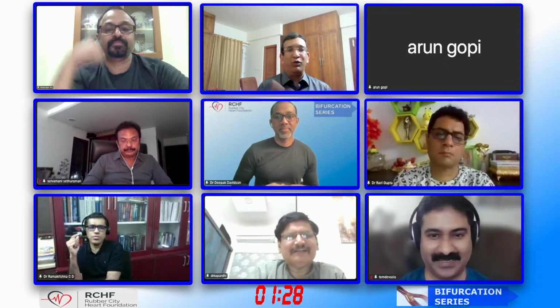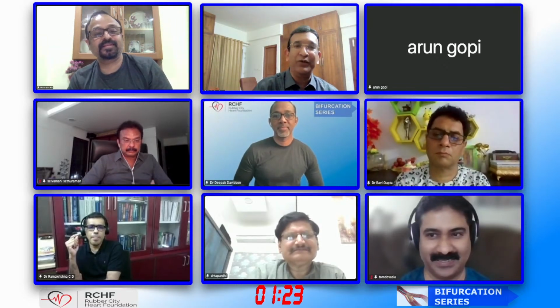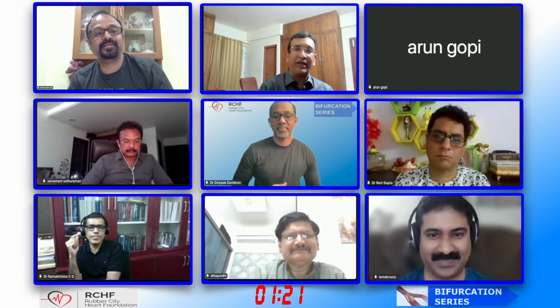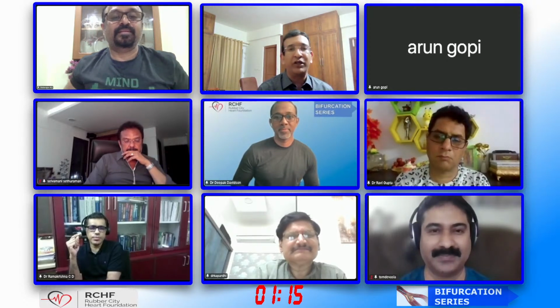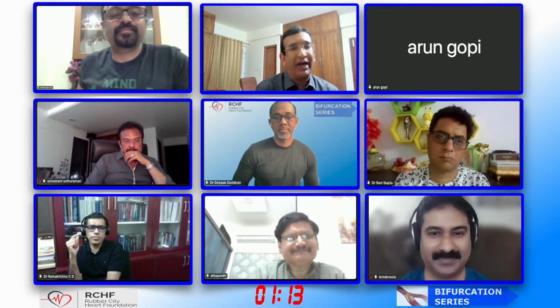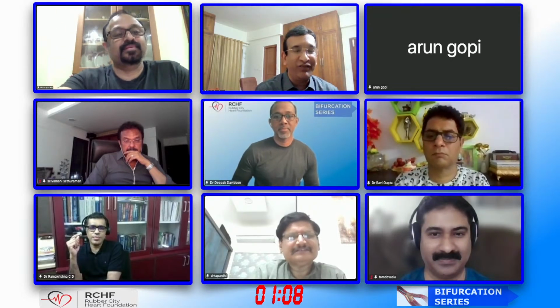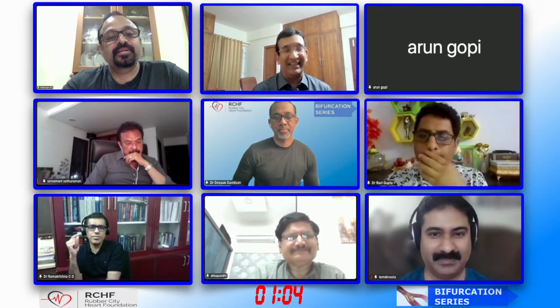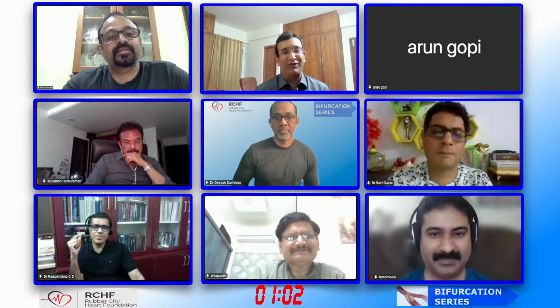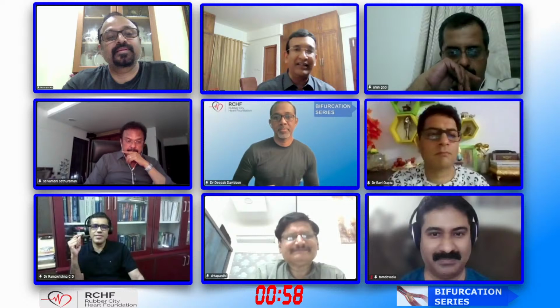Like you would know what you've done, Natarajan. I mean, you're just trying to be nice, but essentially it's this way. You can have the wire going whichever way. You can have the wire going straight, but you can have the wire going into the diagonal and then coming back into the LAD, and that will distort the whole thing. Yes. You never know what's going to happen in the middle. Which is why TAP is generally going out of favor in many parts. And if you talk to Dr. Chen, he would say, I never do it. If you think there is something, you just do a DK crush. But that is the other extreme.